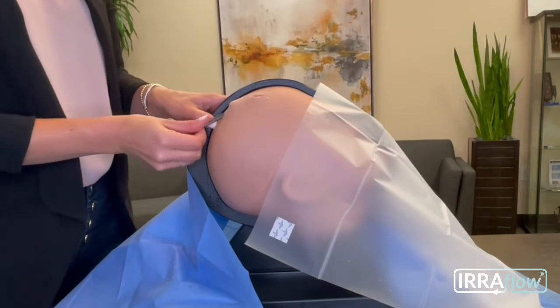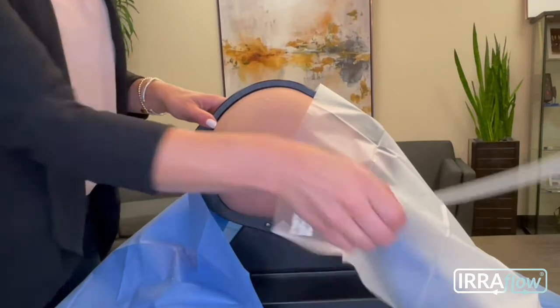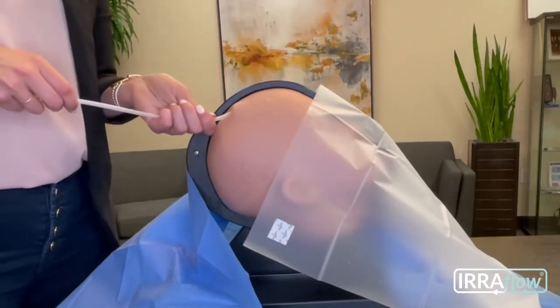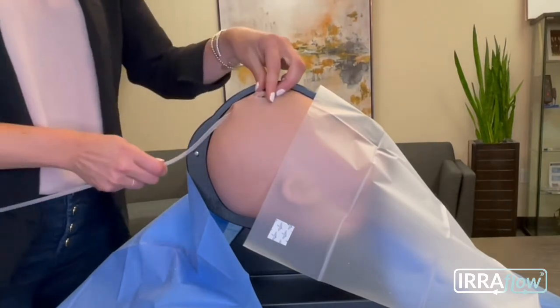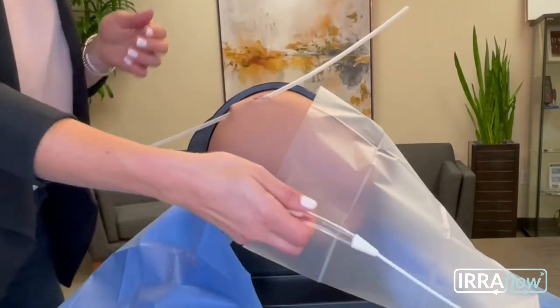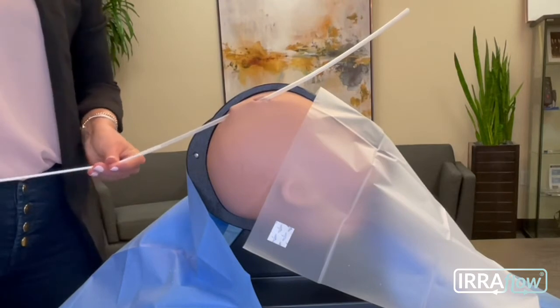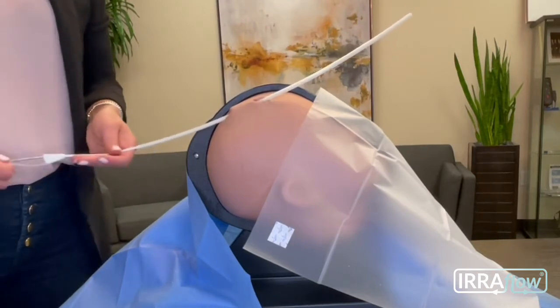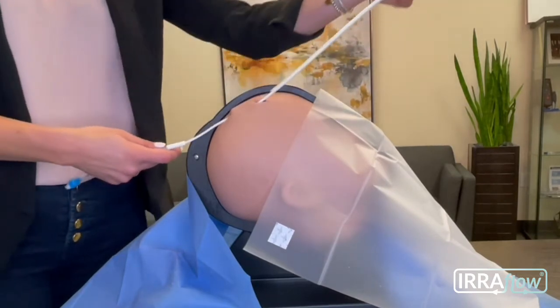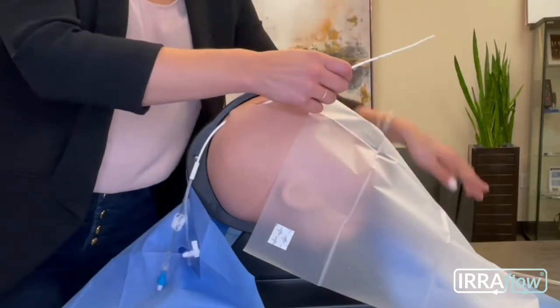Then, you're going to take a pair of Kellys or whatever tool you'd like to create a tract back to that cranial access point. Next, you're going to use our tunneling tool to act as a conduit to get the catheter from the posterior incision to the cranial access point. Once that's complete, you're going to take your prepared IRRAflow catheter and slide it into the tunneling device. You'll want to pull the tunneler and advance the catheter until the hub of the catheter touches the skin at the posterior incision, and then pull out any additional slack to the bifurcation.